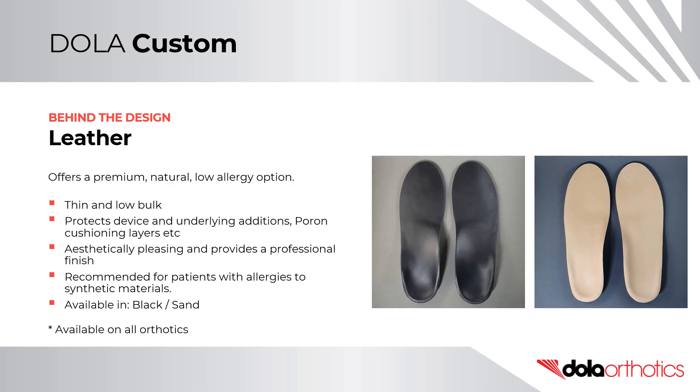Leather offers a premium, natural, low-allergy option for orthotic covering. It is thin and low bulk. It protects the device and underlying additions and poron layers. It is aesthetically pleasing and provides a professional finish. It is recommended for patients with allergies to synthetic materials, and is available in both black and sand on all of our custom and prefabricated orthotics.